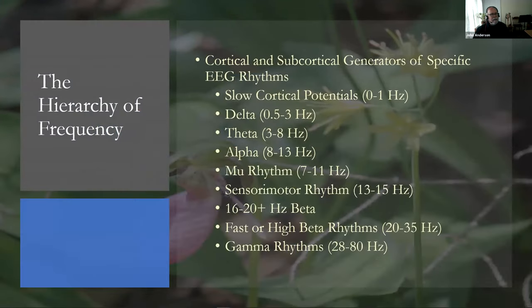So, the hierarchy of frequency. This is going to be just a very, very brief overview of frequency information, what EEG frequencies are and what they represent. The first thing you should probably do is forget everything that you thought you knew about EEG frequencies, because it is probably wrong. Anything that you see in the popular press is almost certainly incorrect when talking about EEG frequencies, because it's much, much more complex.